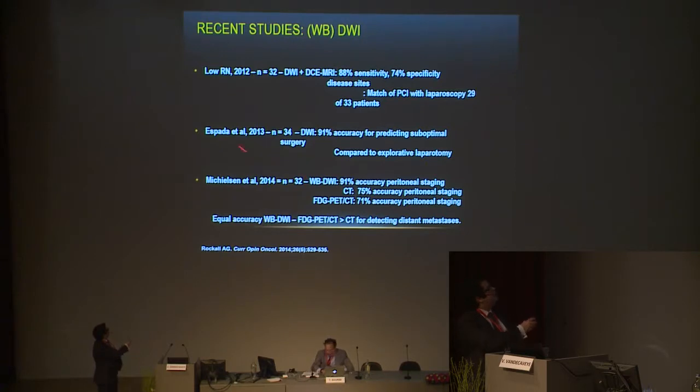A very good study from Madrid with Espada and colleagues, actually a very good study published in European Radiology. And look, 91% accuracy for predicting suboptimal surgery in ovarian cancer compared to explorative laparotomy.